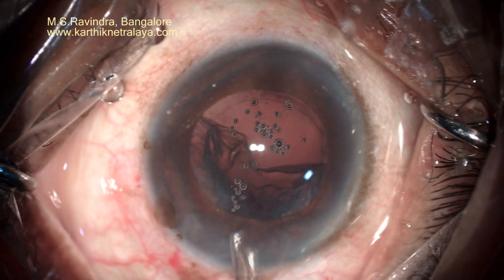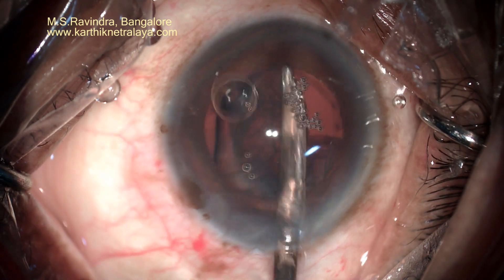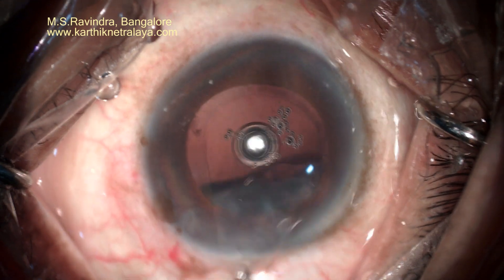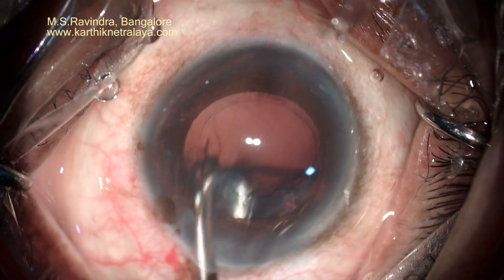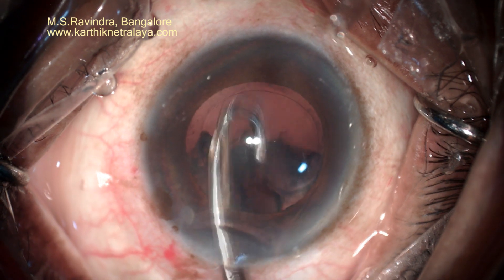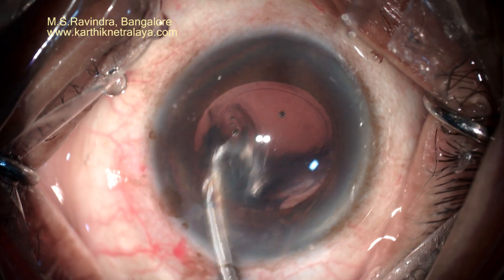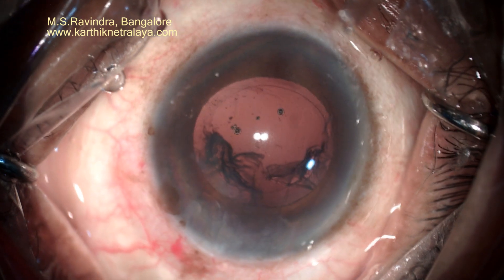The pressure throughout the surgery is normal, atmospheric or slightly on the higher side. It is never above 20 or 22 mmHg at any point in time. The cortex is aspirated with a straight Simcoe cannula as well as J-shaped Simcoe cannulas.